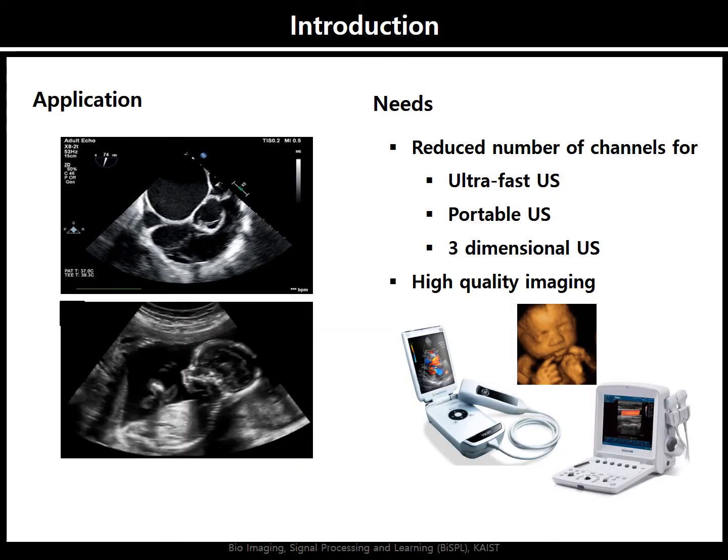Ultrasound imaging is based on acoustic signal, and due to its non-invasive, radiation-free and real-time acquisition features, it is considered as the first choice for a variety of clinical applications such as fetal or cardiac imaging. It is a robust imaging modality. However, it suffers from low frame rate and poor imaging quality.